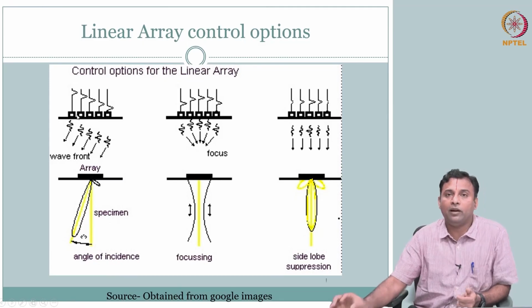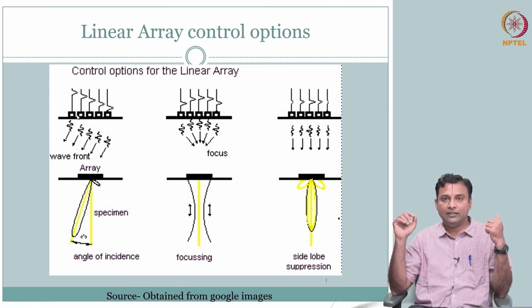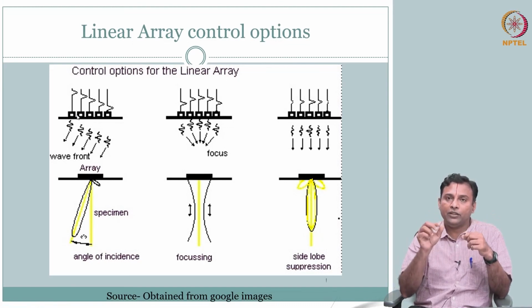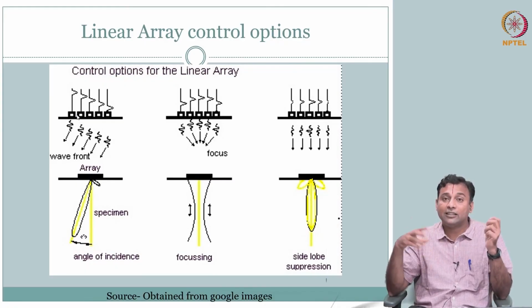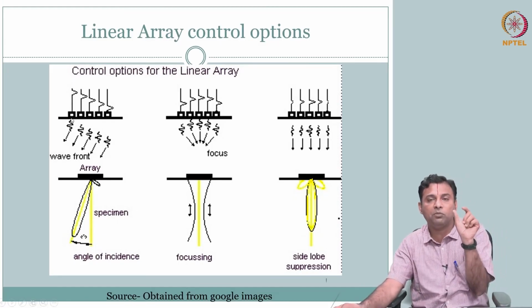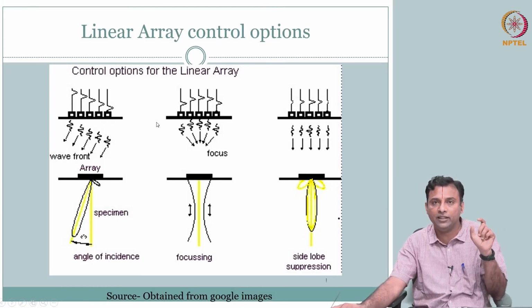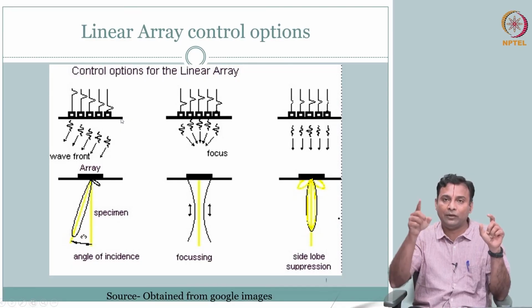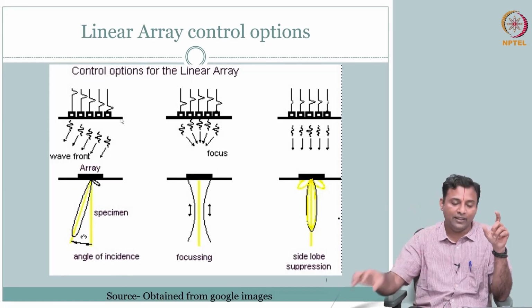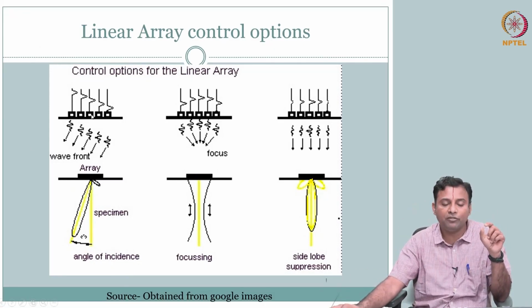So I can send, remember now your wave physics that we covered. When you hit an element, you excite, what is happening? If it is a point source, you are going to get a spherical wave. So what do you see here? Now my elements are getting smaller and smaller, and many of them are placed next to each other. Instead of having one full transducer surface where we integrated over the full surface area S of x naught comma y naught, here you have many of them. So I could actually integrate only over the small area. So in some sense there is a localization.